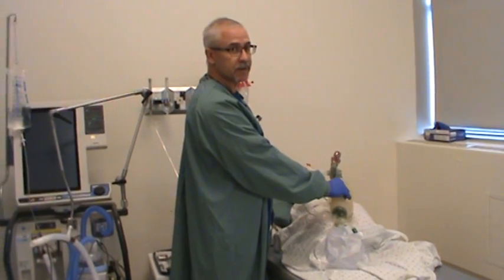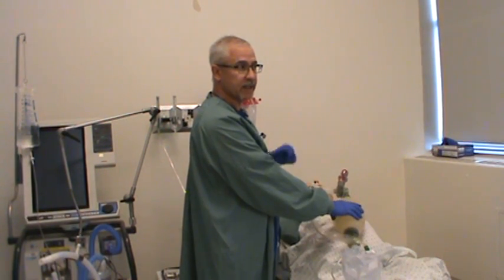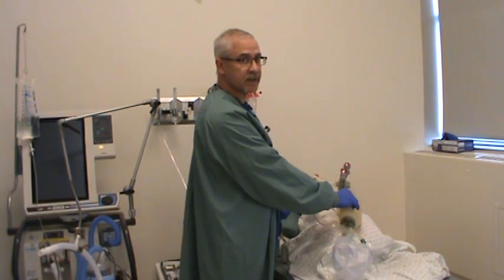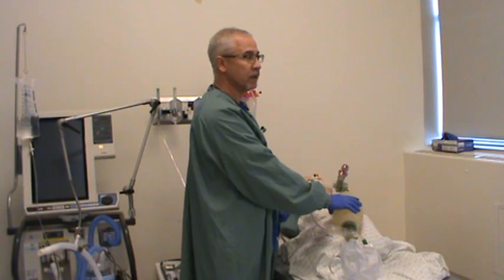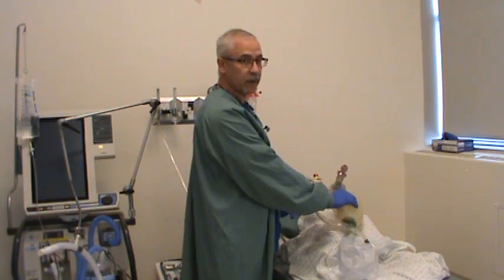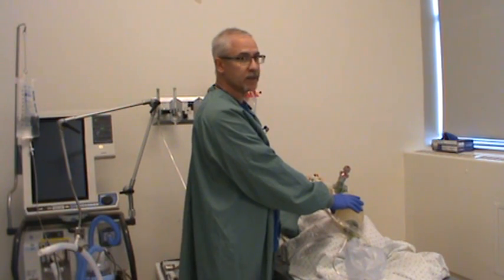When it comes time to suction your patient, advance the catheter so it goes down into the patient's trachea. When you hit resistance, stop, pull back a centimeter, then apply suction for roughly 10 to 15 seconds. Always hyperoxygenate your patient for at least two minutes prior to suctioning on 100% oxygen. You can do that with your ventilator, or in this case I have the bagger hooked up to the patient's airway providing 100% oxygen. Always tell your patient what you're going to do as well.